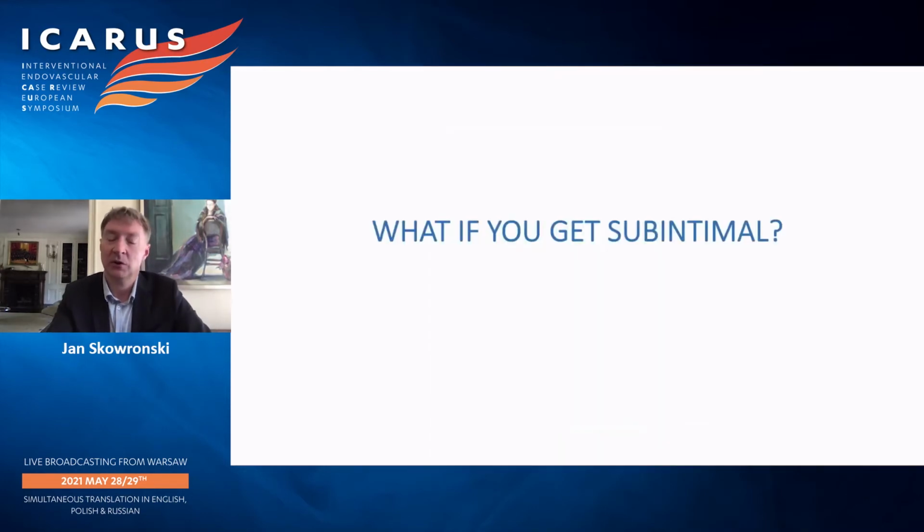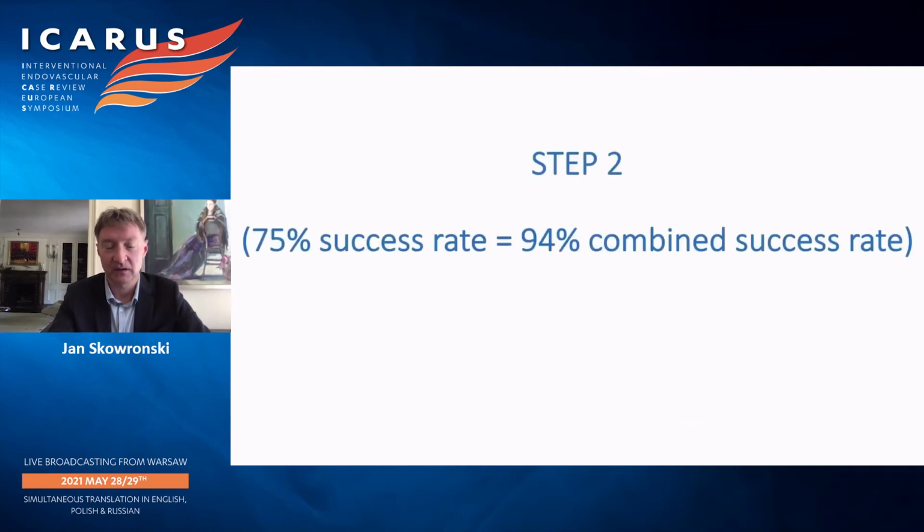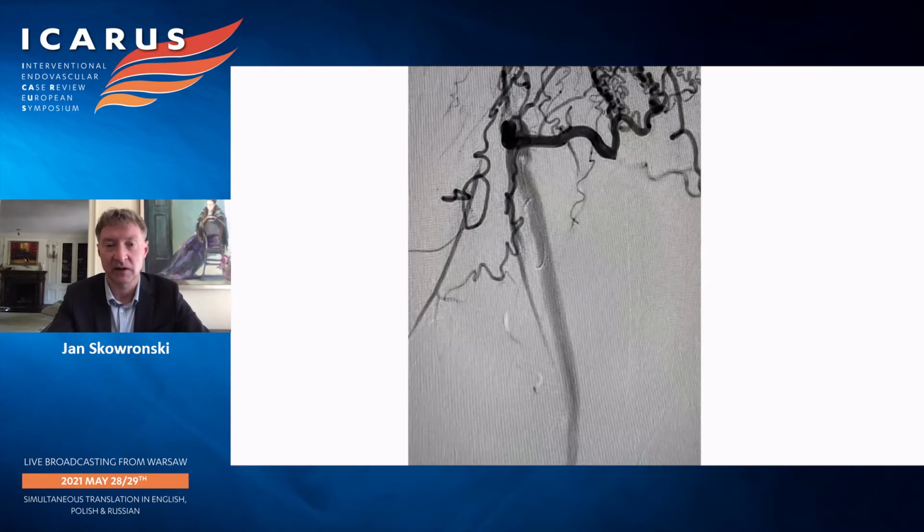But you have about a 1 in 4 chance of getting subintimal in those cases. So then you go to step 2, and step 2 will bring you also about 75% success rate. So you will be at a combined success rate of about 94% if you master this technique. And the technique is a reentry device.